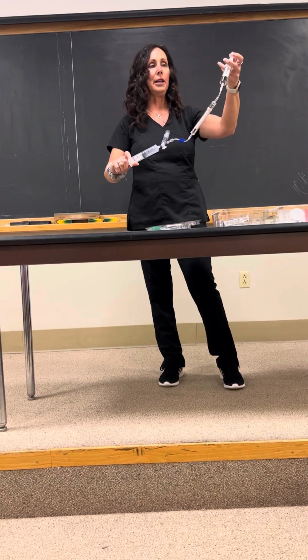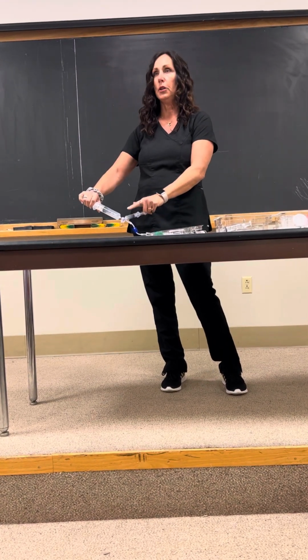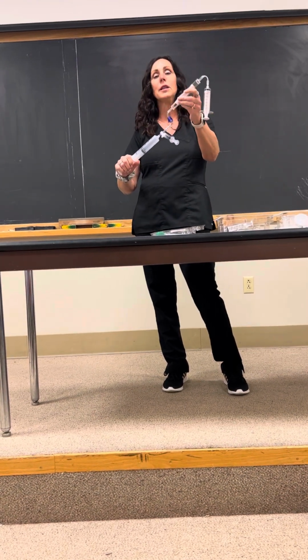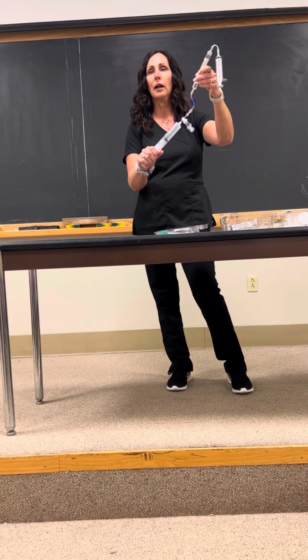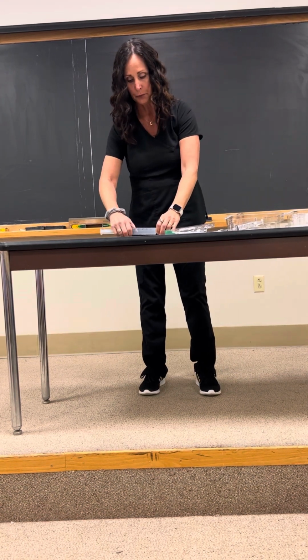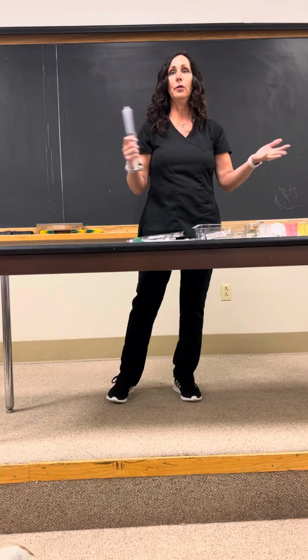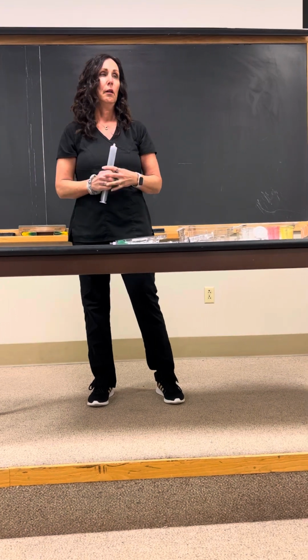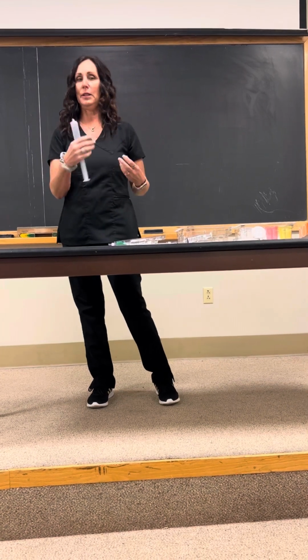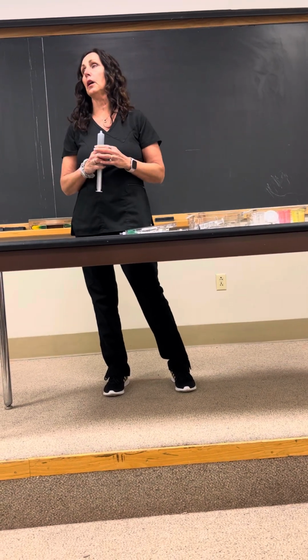Again, if you have any trouble with clotting and not getting this to come through the filter, disconnect your marrow syringe and use your heparin to flush through again. That usually will help to get it through. Oftentimes you can also pinch this and get at least the liquid portion around that clot to come into your 60. Once you've got your full 60 of marrow, you simply disconnect and hand that off to Jacob or to Butch or whoever is there running Magellan. And that's it. I know there are several steps involved, but it's fairly simple: make sure everything is flushed with heparin, load your ACDA, and the surgeon's ready to go.